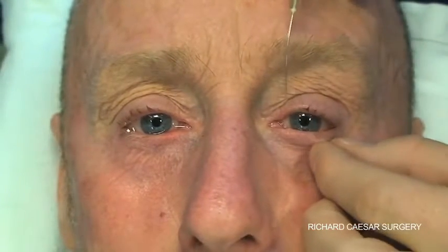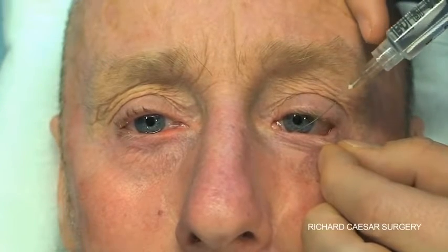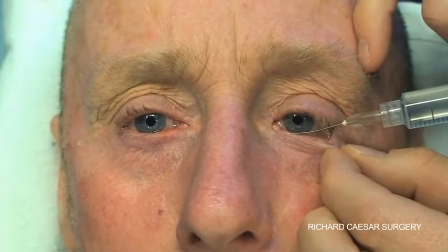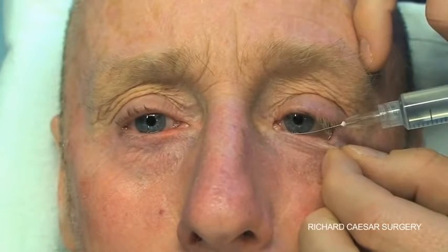Change grip for the left eye, using your thumb now to depress the plunger if you're right-handed. Again, balance your hand on the patient's forehead and have absolutely no pressure on the tip of the lacrimal cannula as you slide through. This will keep the patient comfortable throughout the syringing technique.